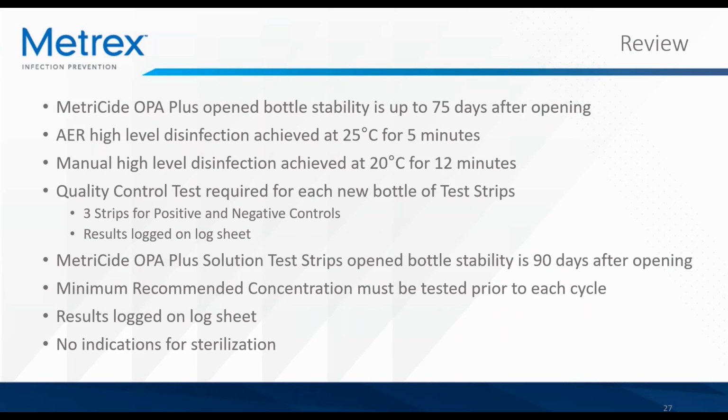Some quick review before we go into FAQs. MetriCide OPA+ open bottle stability is up to 75 days after opening. AER high-level disinfection is achieved at 25 degrees Celsius for 5 minutes. Manual high-level disinfection, manual soaking, is achieved at 20 degrees Celsius for 12 minutes.